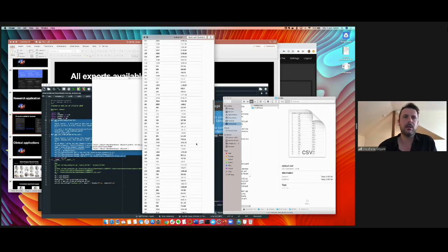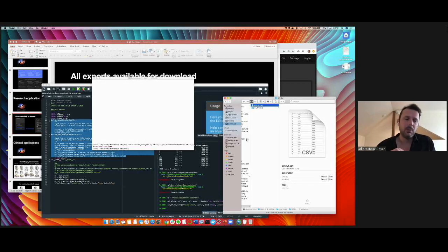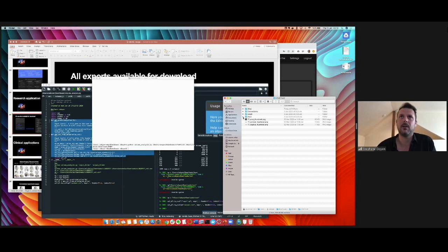So if you're running a research study, for instance, where you're testing and retesting a subject, you want to compare between two treatments, if there is any kind of change in parcellation, well, you can do that, right? You can basically run the subject once, pass it through the platform, get it back to you, run that analysis, and then test the subject again, run the same analysis, compare it. The same applies with basically everything else that is available here in this bag of data.